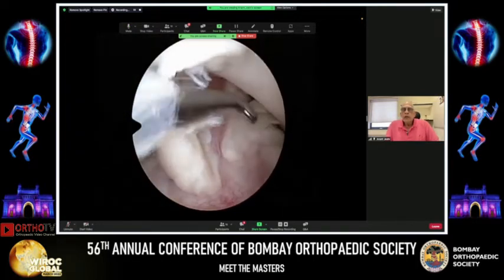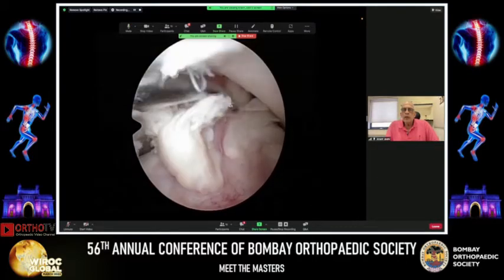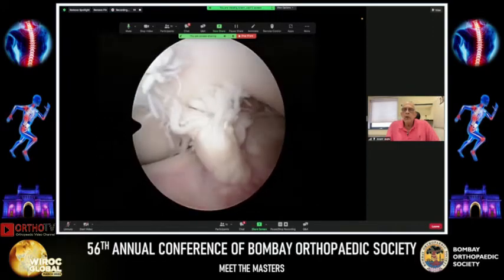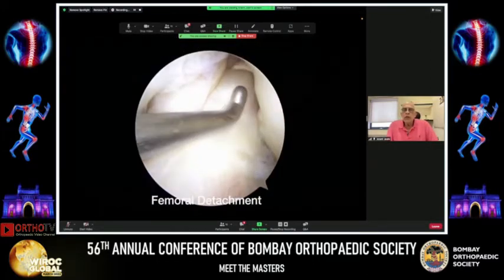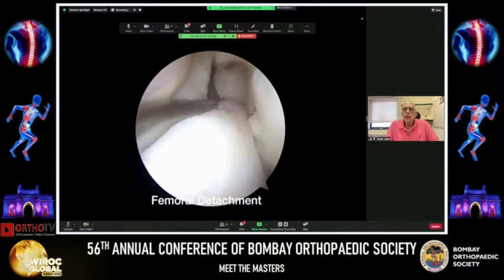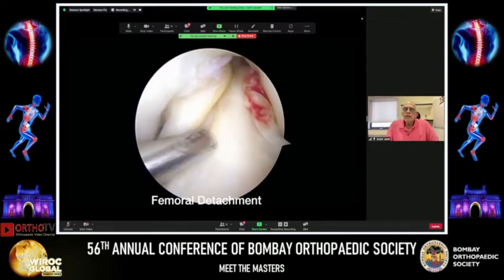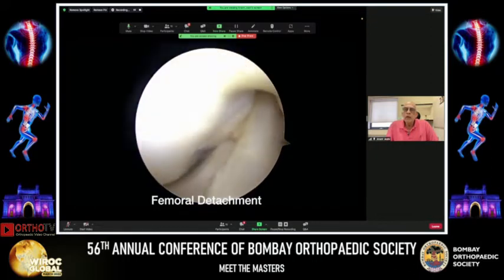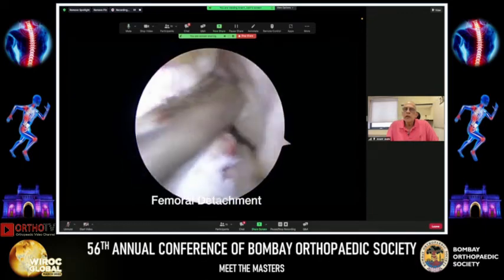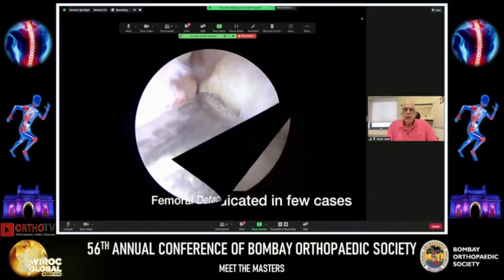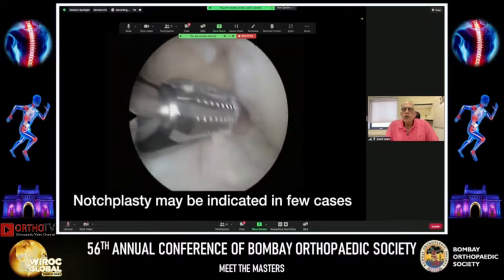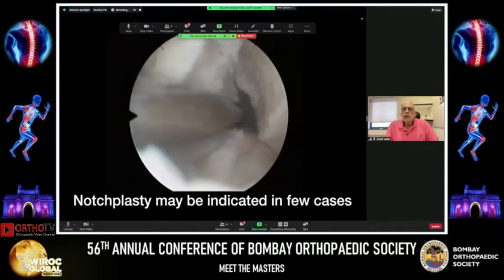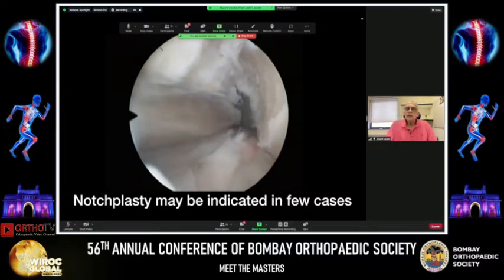There are two scenarios. In a complete mid-substance ACL rupture with no salvageable stump, graft requirement is higher and you need a robust graft. Where there is a femoral detachment, you can trim the nodule, save the majority of the remnant, and graft requirement is much less — even a doubled or tripled semitendinosus may suffice. At this stage, one can also assess the notch; notchplasty may be required in chronically deficient ACL cases where the femoral footprint is difficult to identify.